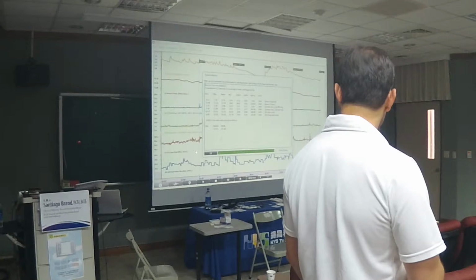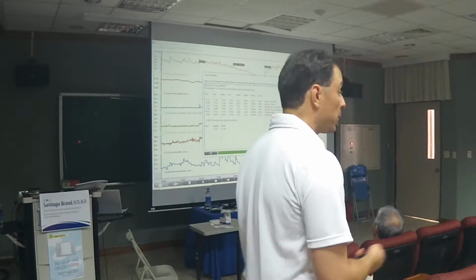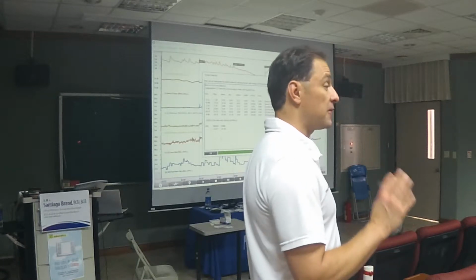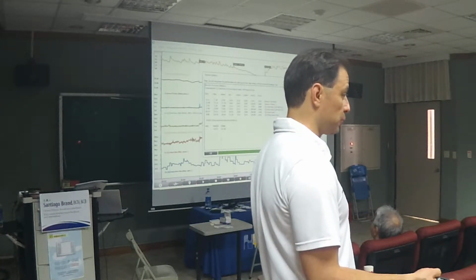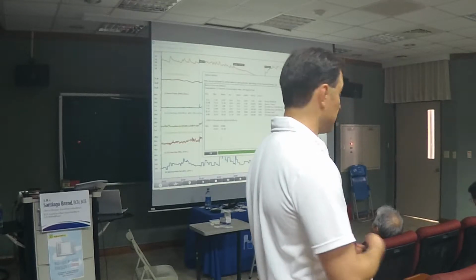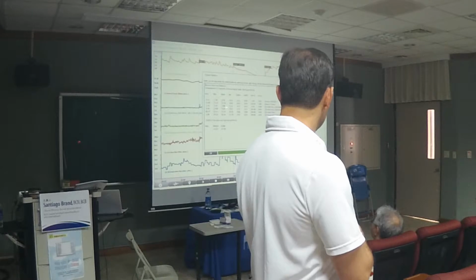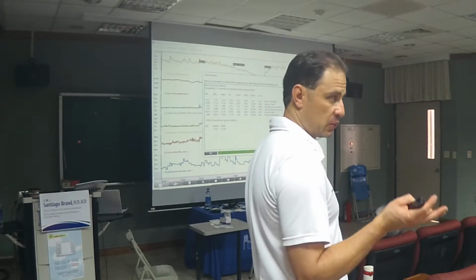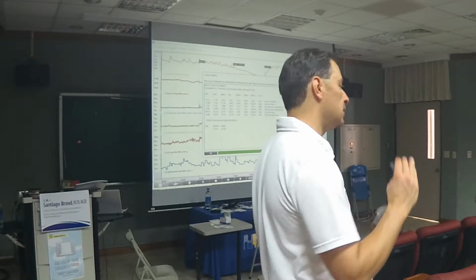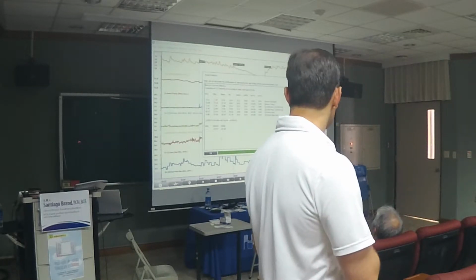72.43 for the baseline. Again, that's not bad for his age; it's normal, but we can make it healthier. So the fact that it's okay does not mean that we cannot improve upon it. We do improve upon it, right? We can make it lower. 5.3 for the shoulders, 3.68 for the neck. That's good. We're within the values, right? Remember, EMG, 5 microvolts or less for any muscle group.